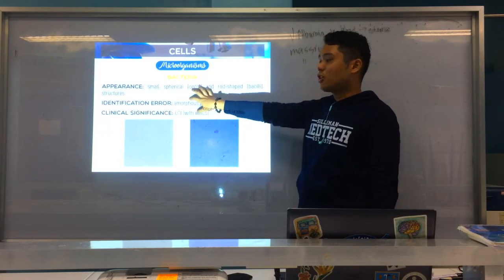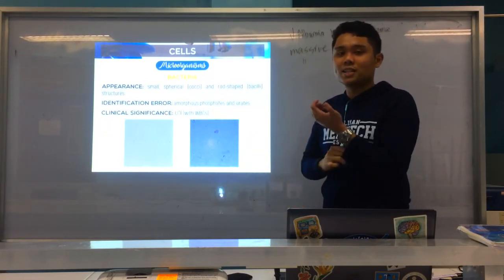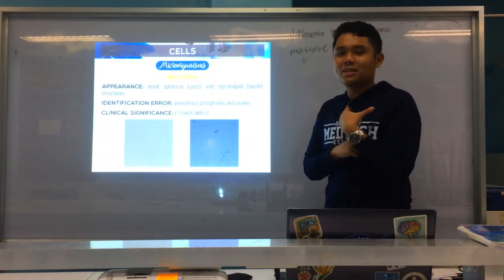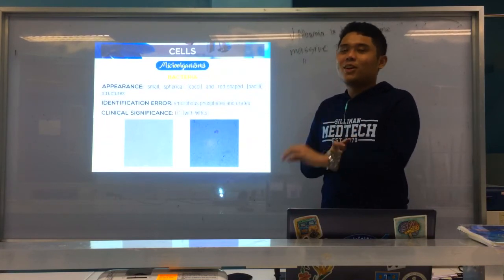Significant is UTI. It could be cocci or bacilli. But again, the most common cause of your urinary tract infection, kinsa to na bacteria? E. coli. Wag na mag-isip. And E. coli, unsa man? Cocci ang E. coli or bacilli? Ginoo ko, Lord Jesus. E. coli is a bacilli. Okay.